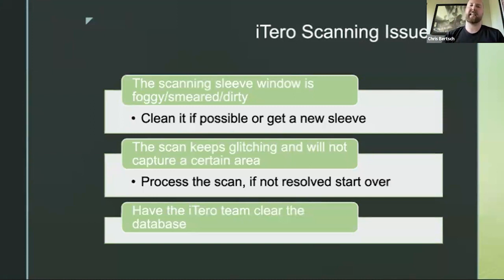If it's not working, I just restart sometimes. The other thing is we use our iTero a lot with Invisalign and lab work, so we need to call frequently, it seems like every few months, to get the iTero team to clear the database. They'll do that for us, and that helps a lot too.